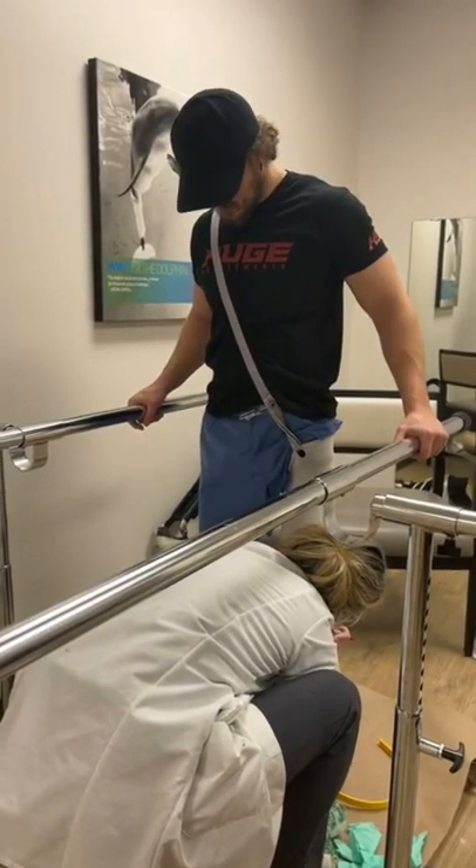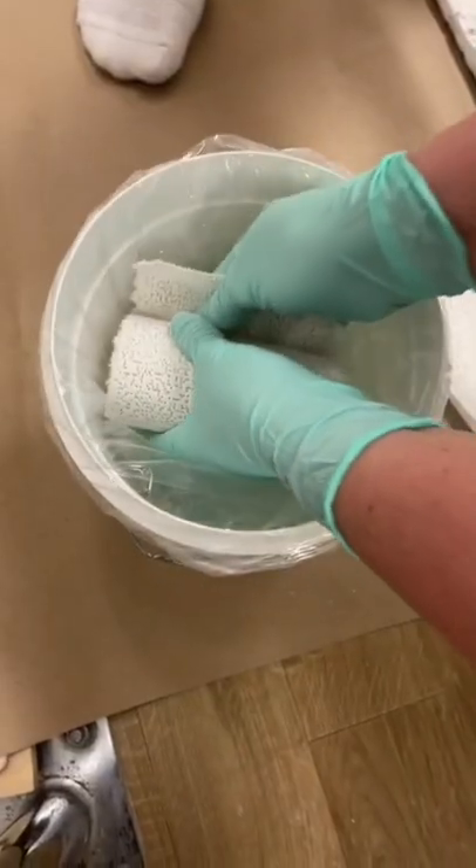This is a video on how the top of my prosthetics are made. First, I get this little stand here so I can stand up. Then we put holes in my sock and attach this strap to it to hold my sock up.